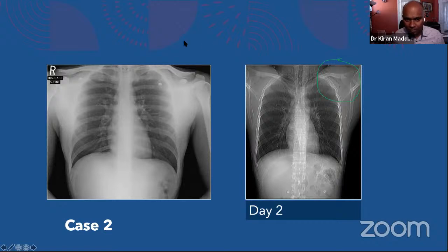So always remember, Victor, we're dealing with trauma. So I'm trying to show you the obvious findings. I'm not trying to teach you or cheat you. These are real things which make a difference in the management of the patient.